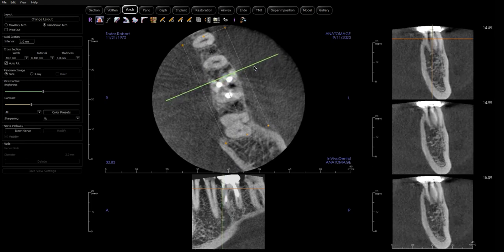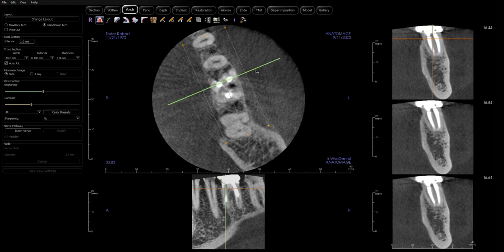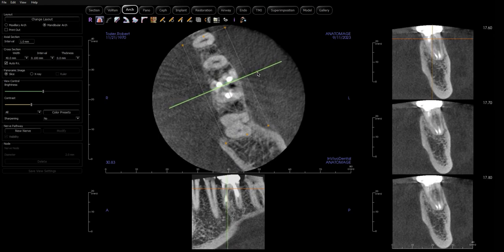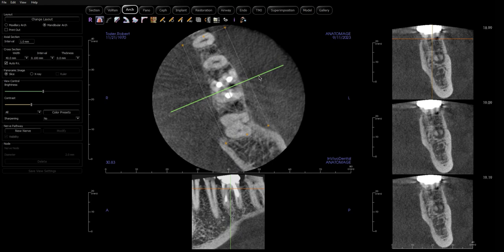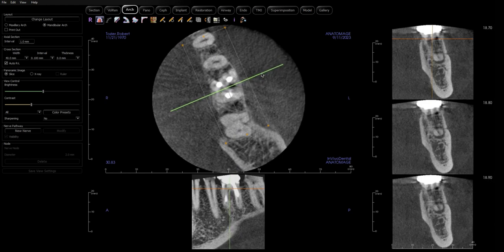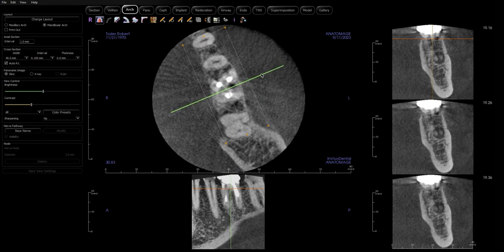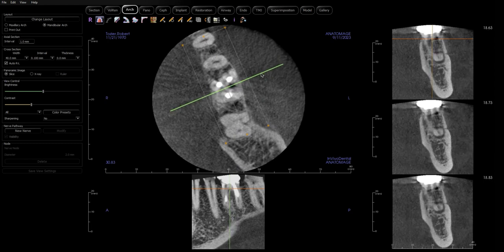Looking at the mesial roots, the fills look good, but right about here we start to see widening of the PDL. We also see what looks like a fistular sinus tract coming out the buccal that may or may not be clinically significant at this point, but it looks like it's trying to drain. My guess is if you looked in that area you would probably see something.